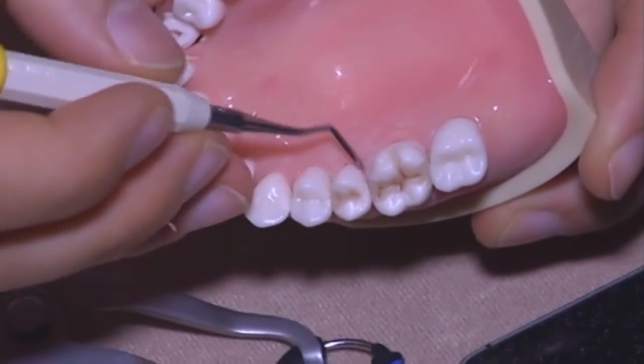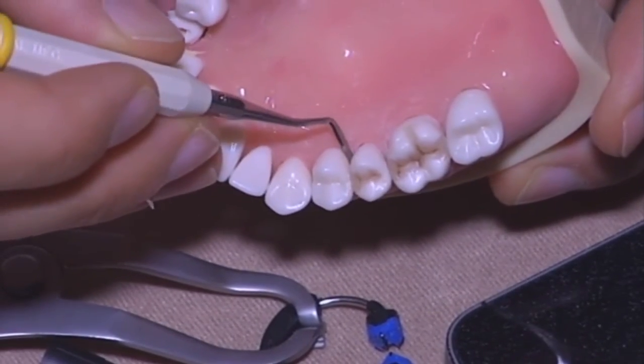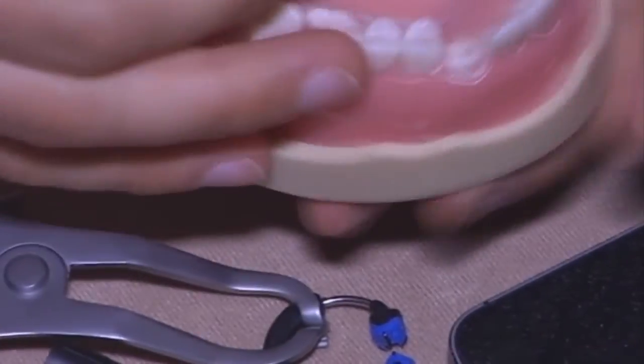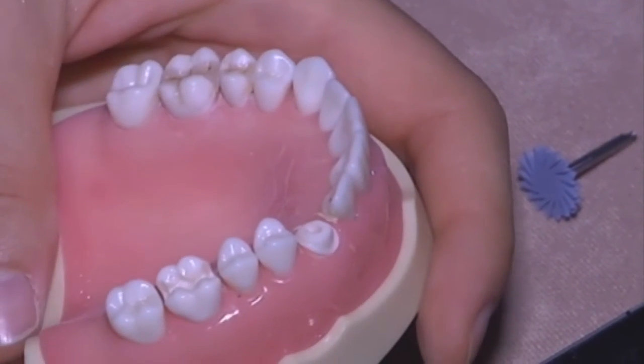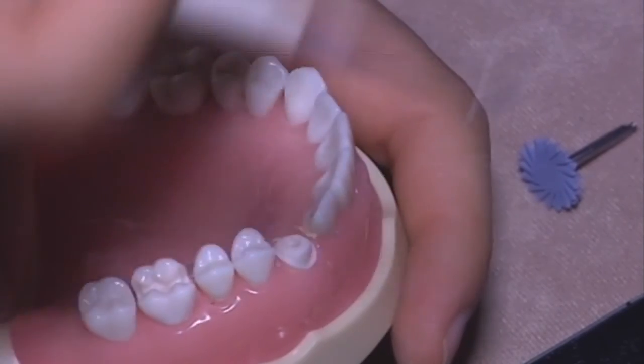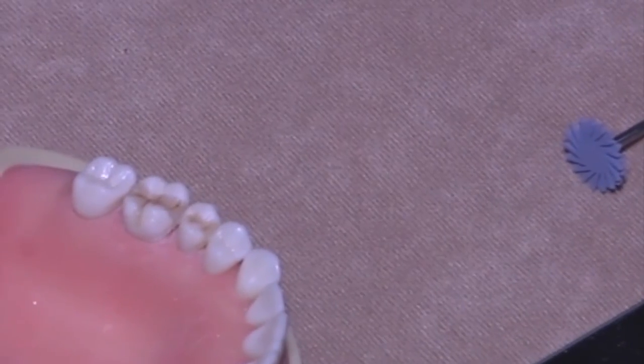The only last step you have to do, sometimes if you have a little bit of excess under the occlusal contact here, you just have to pass an interproximal strip, just cut it, divide the interproximal strips we used to have, they are too high.